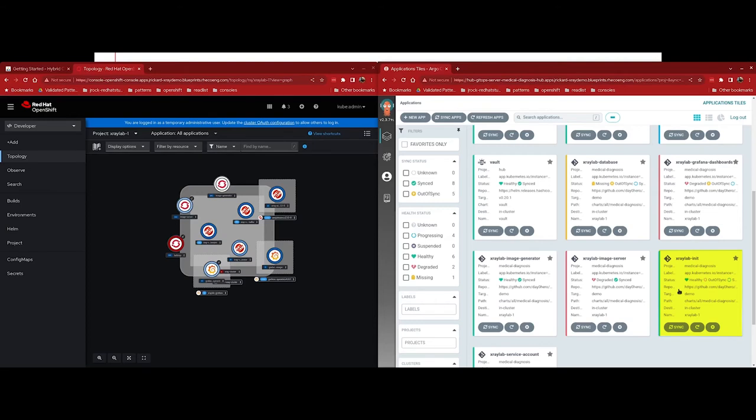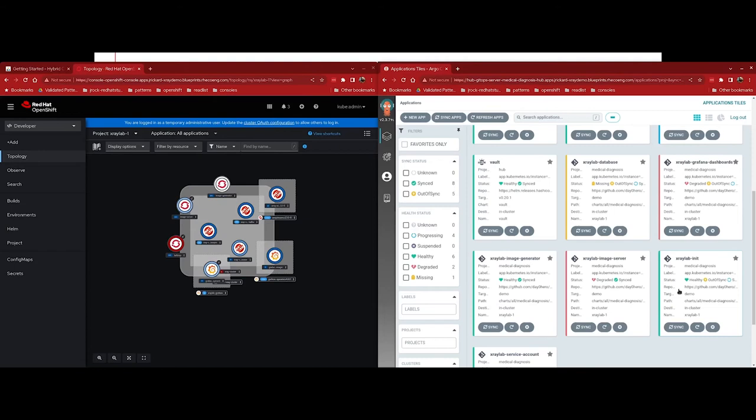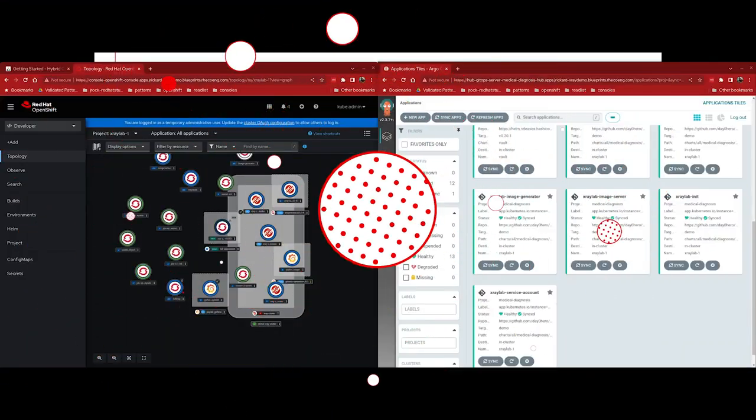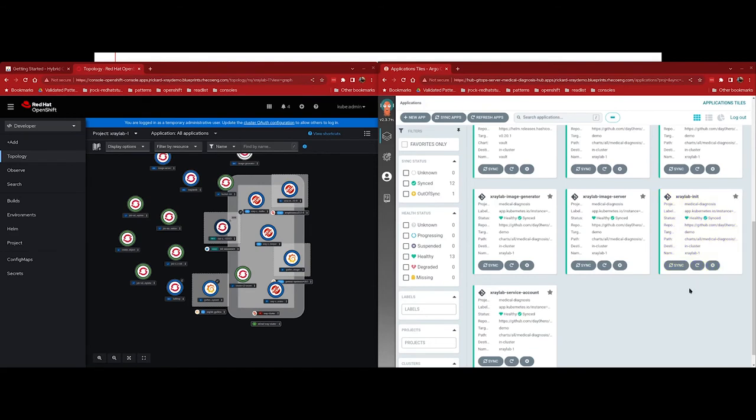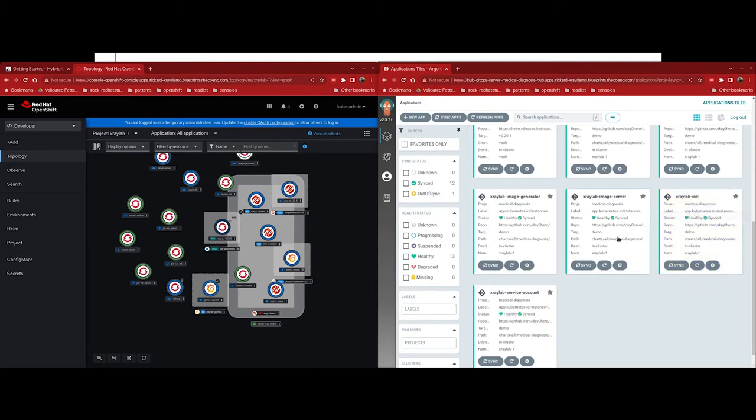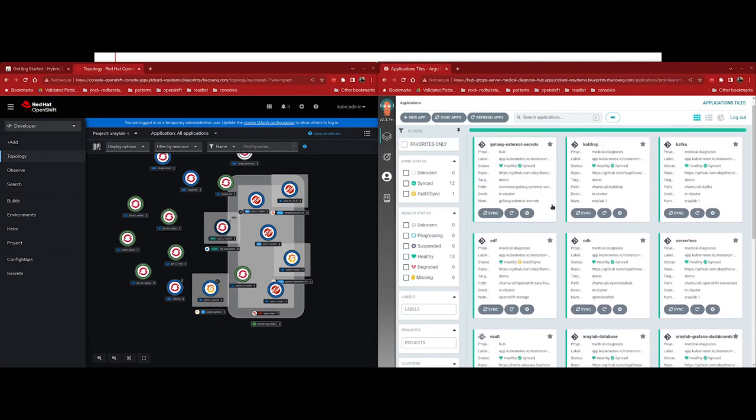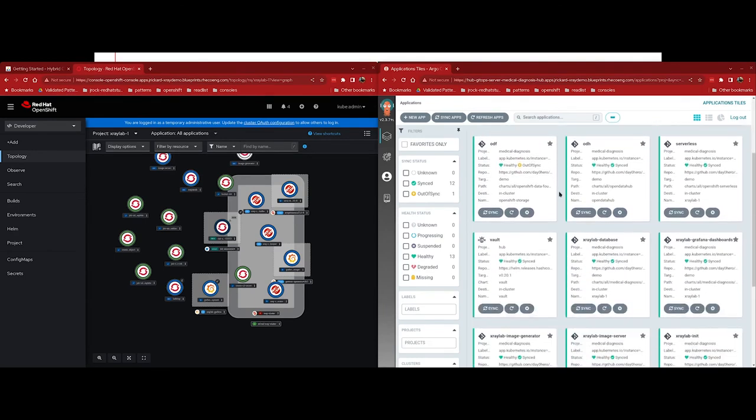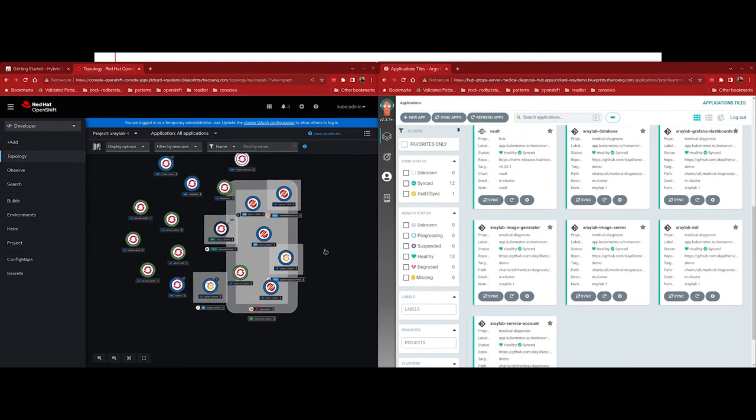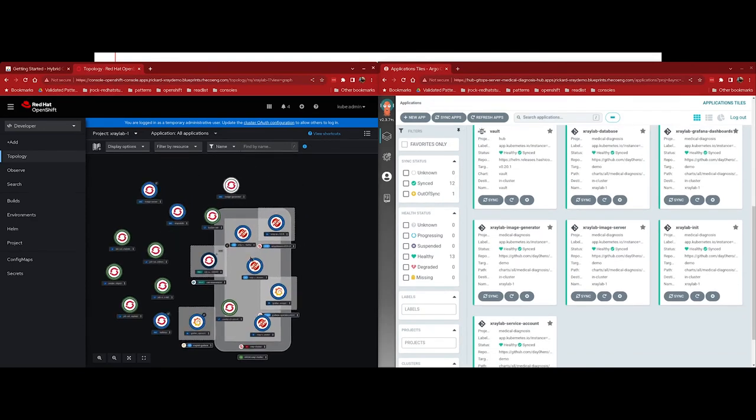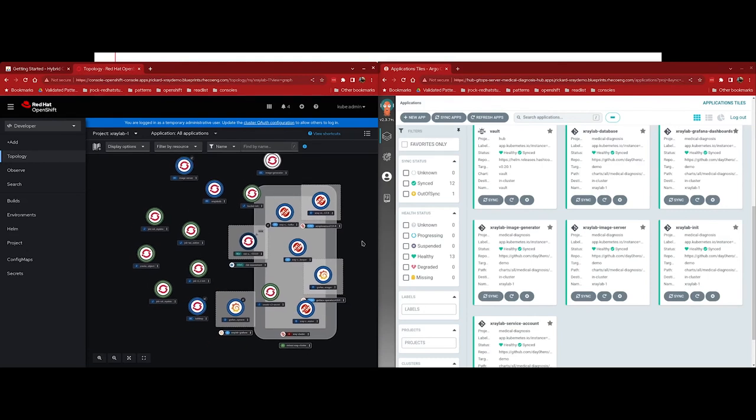The application to keep an eye on is xraylab-init. And that's because that's the last application to complete before the medical diagnosis validated pattern has successfully completed its deployment. It has Kubernetes jobs and some other resources within it that wait for parts of the ODF operator to complete before moving on to its next phase. And this is because of the amount of time that it takes for ODF to deploy. It can take upwards of 10 minutes for the entire operator to deploy. So we had to create some jobs that will go out and wait for those resources to become available. Instead of sitting here and watching the console, I'm going to pause the video and come back when the deployment has completed. So we can see now that xraylab-init has finished syncing. So it's healthy and synced. And so now our application is completely deployed.